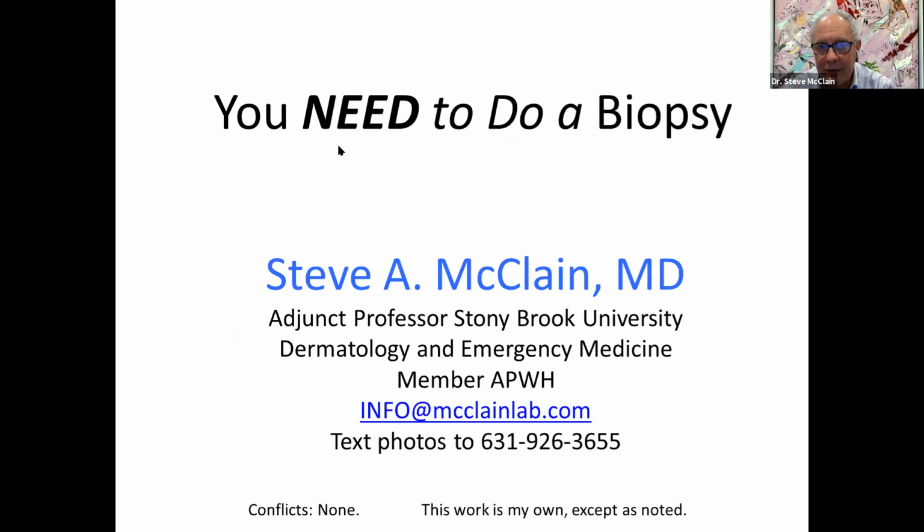So the title is You Need to Do a Biopsy. The first decision you have to make is that a biopsy is needed. And the reason for practicing now is you don't want to come up to a patient never having practiced before. For those of you who have animal issues, you can try potatoes. You can try biopsying the peel of an orange or even an apple. So those are acceptable alternatives. It's really about developing the muscle memory.